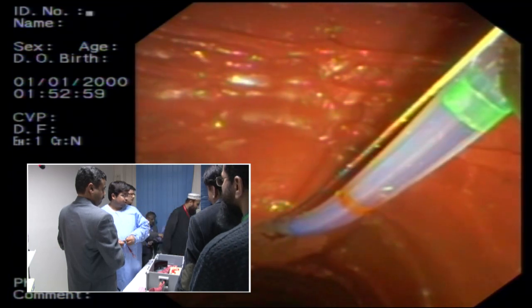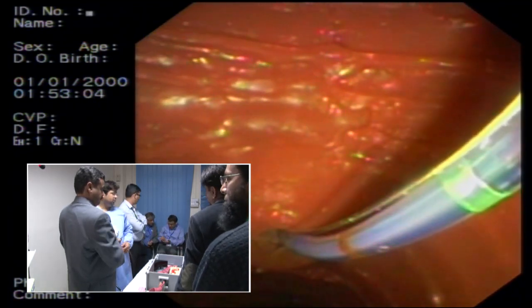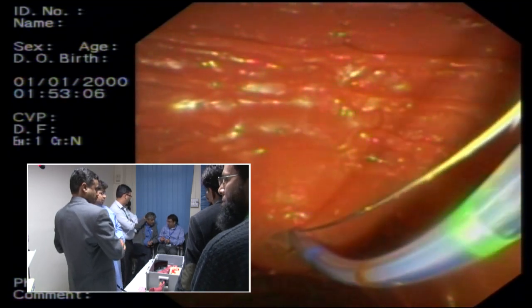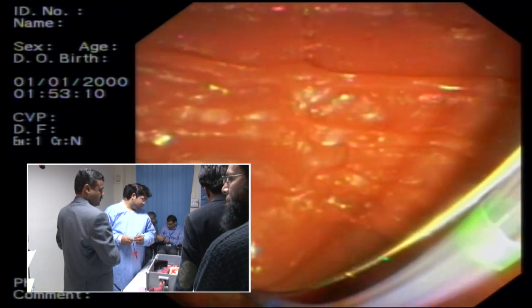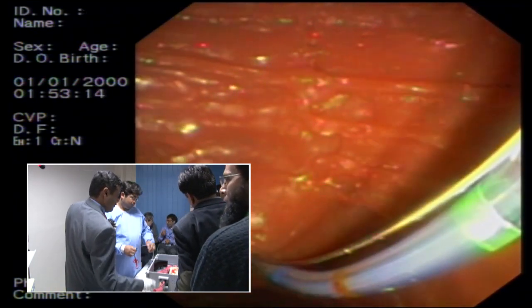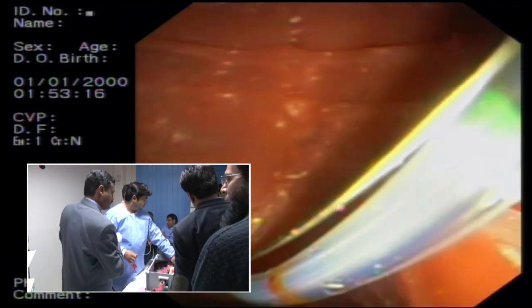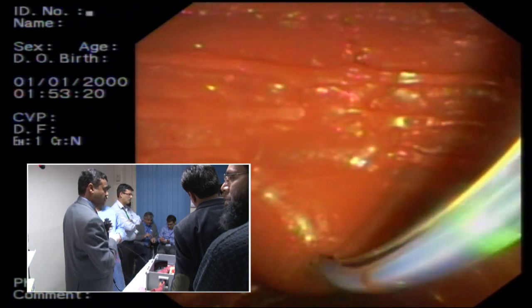I use 5. और दूसरा ये कि मैं if it's a temporary, ठीक है, I cut this length. Yeah, if it's just for prophylaxis, you may take it. No, I don't want it. Look, I want it to come up. Otherwise, you need another endoscopy to take it. That works well for us.